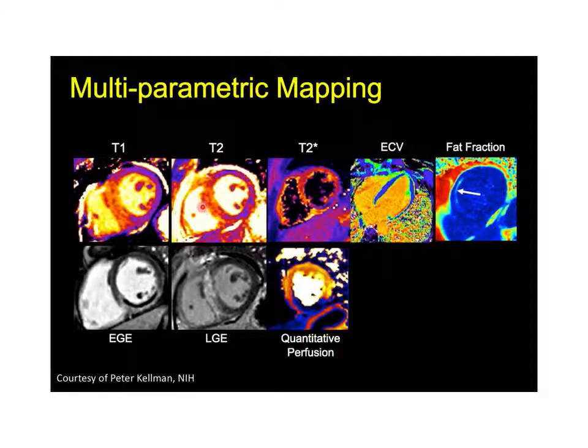Similarly, whatever's going on in this septum is affecting the T2 such that the signal decay is slower, the signal is lasting longer, and the T2 value is higher. T2 star is the T2 we measure when we don't use a spin echo, when we let all of the mechanisms that decrease signal coherence occur. T2 star is always shorter than T2.